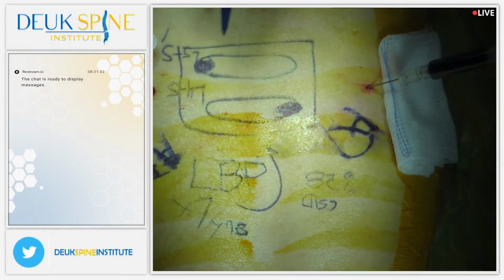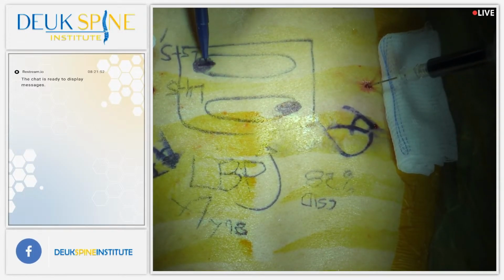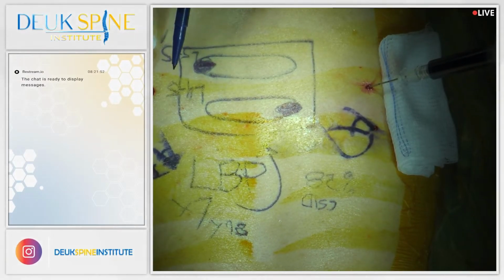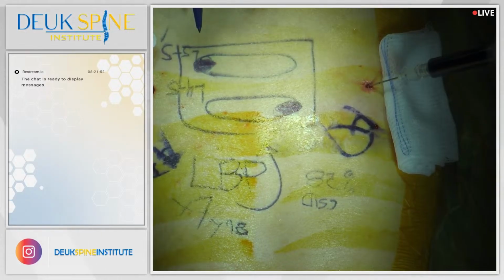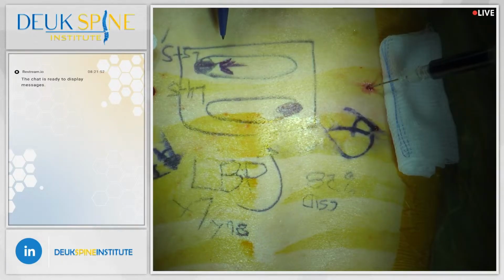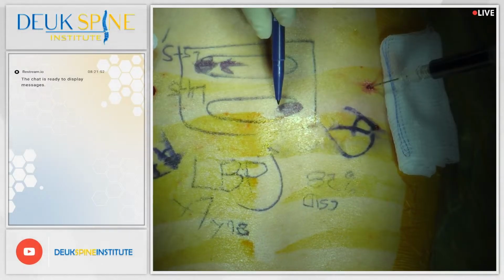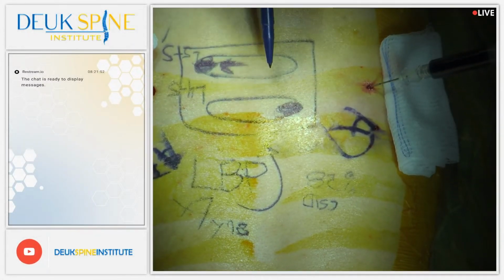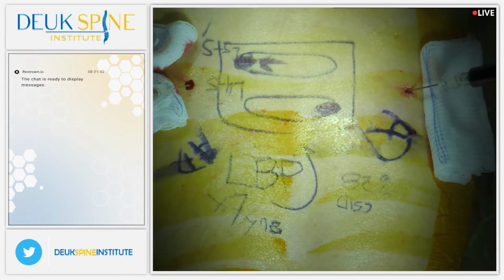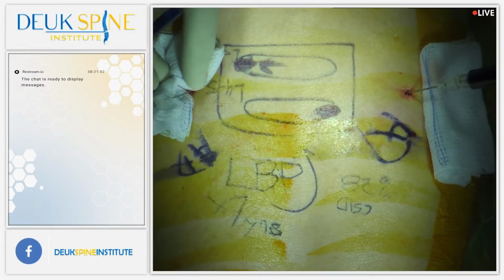That's what his back pain is coming from. He has a tear at L5-S1 within the ligament holding the bones together at L5 and S1 bones. It's called an annular tear, specifically posterior annular tear in the back of the disc to the side. He's got nuclear material that has migrated out through pressure and time, stuck inside the tear, causing inflammation and back pain. Same thing on the L4-5 disc. The L4-5 disc has the same problem, but it's on the opposite side. Everybody agree, left L4-5, right L5-S1. Yes. That's what we're doing. We have left 4-5, right 5-1.